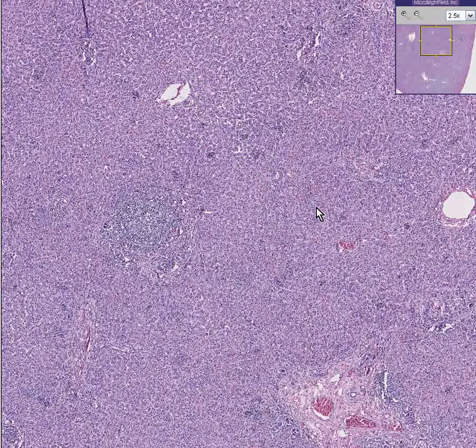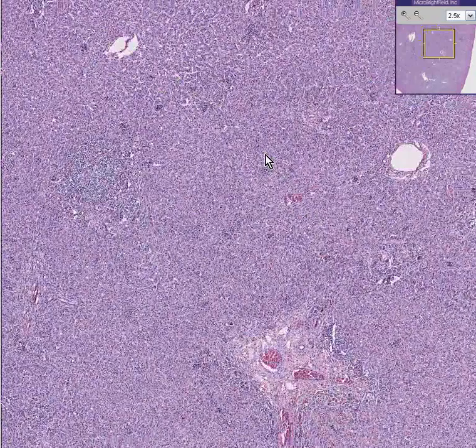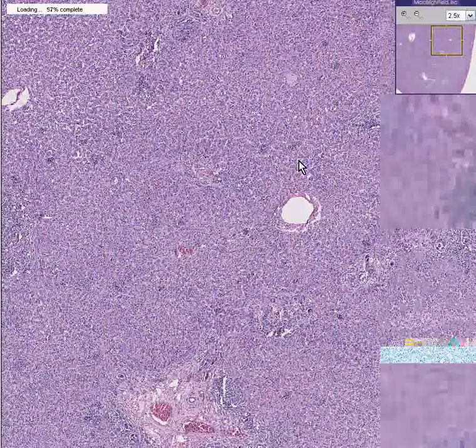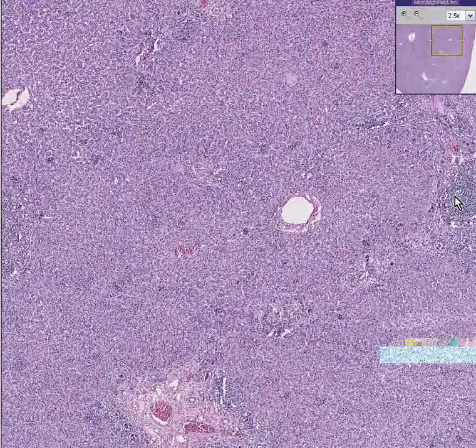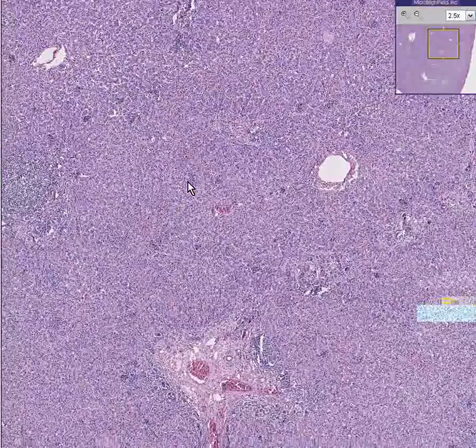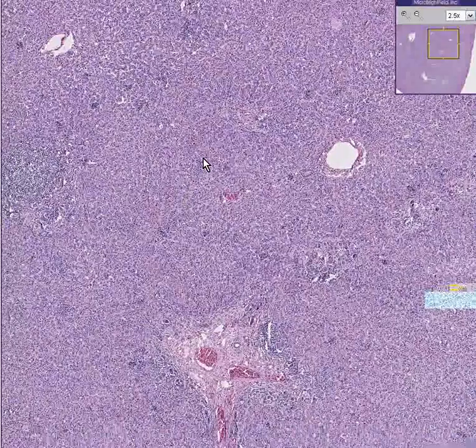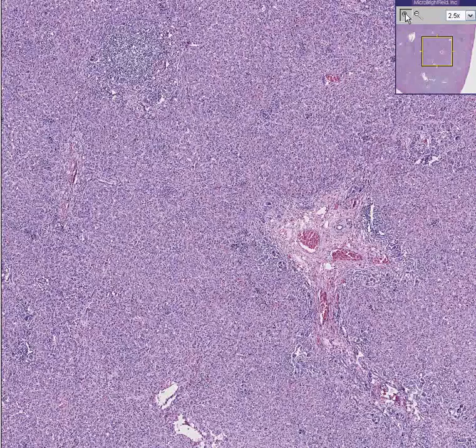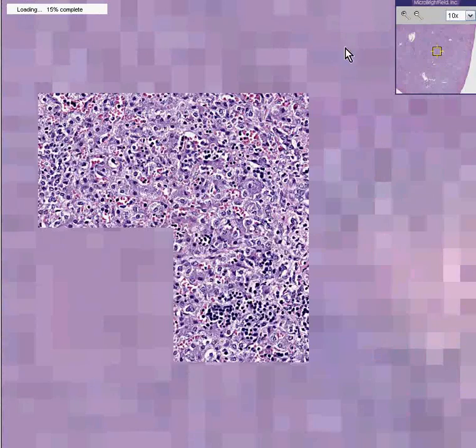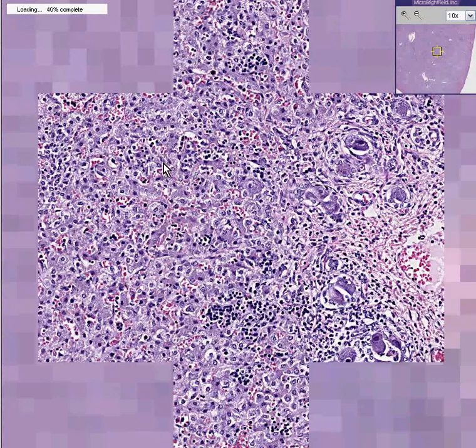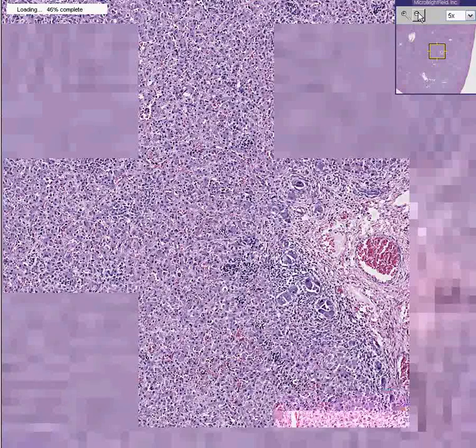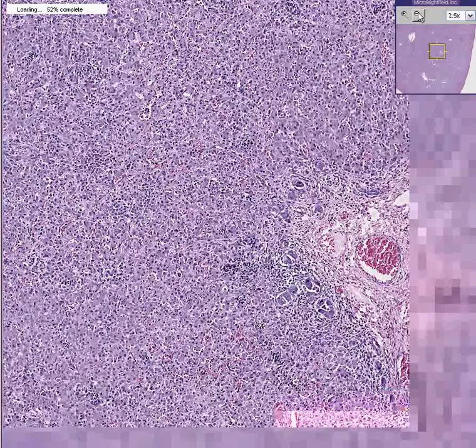...of chronic inflammatory cells studded throughout the liver — both as little clusters, lymphoid clusters like here and like here, as well as very significantly diffusely throughout the liver parenchyma everywhere. Let's verify that by showing you there are probably more lymphocytes in these fields than there are liver cells.